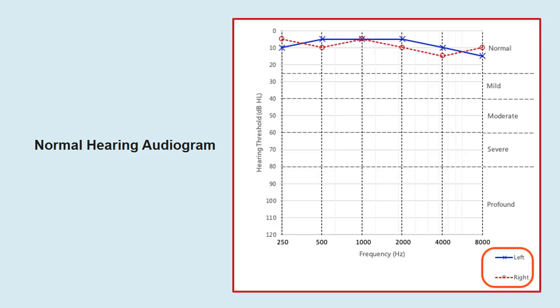Normal hearing is 0 to 25 dB. Conductive hearing loss, where bone conduction is normal and air conduction is reduced, which means there is an air-bone gap. Sensorineural hearing loss, both air conduction and bone conduction are reduced and there is no gap. The common patterns include sloping, which is due to presbycusis or age-related hearing loss. A notch at 4 kHz is usually due to noise-induced hearing loss, and a flat loss shows conductive hearing loss.